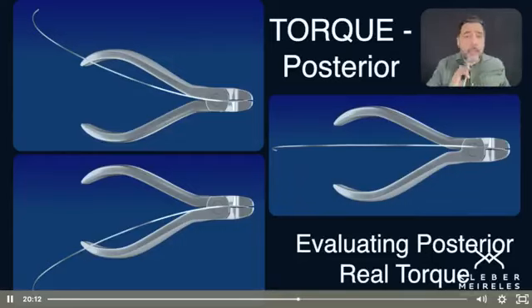But nowadays we don't use edgewise brackets, meaning non-programmed brackets, anymore, or we use them little. We don't use that much, let's say. And in the past, we needed to do the progressive torque in the posterior segment, but you don't need to do that anymore unless you're using edgewise appliances, because the torque is already embedded in the bracket.